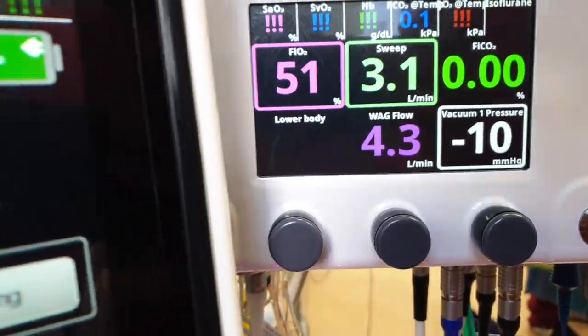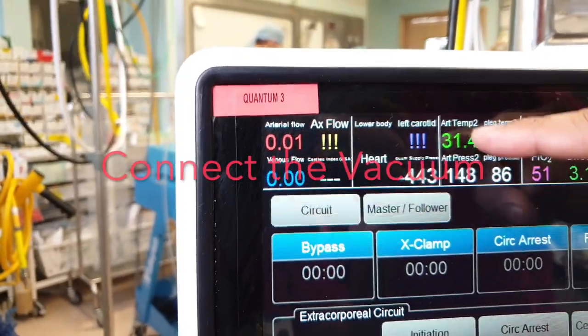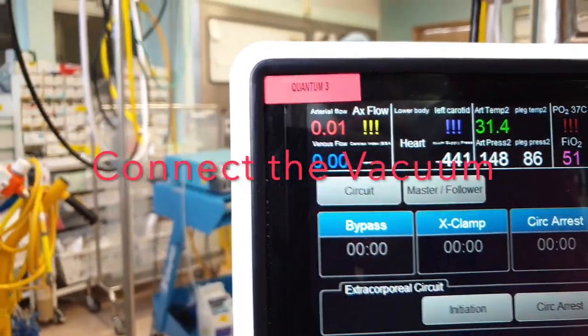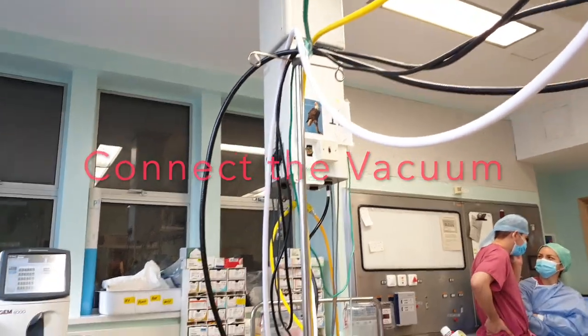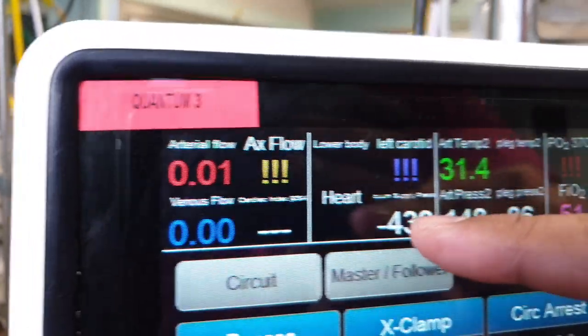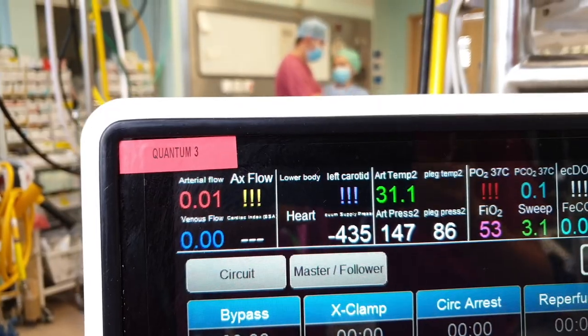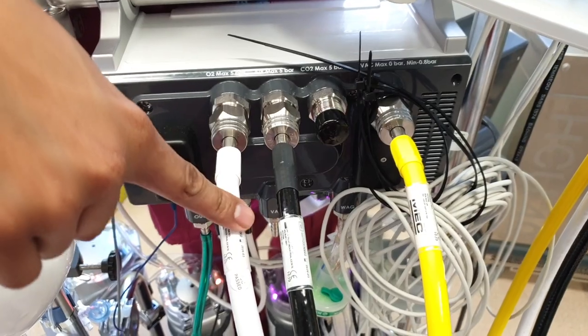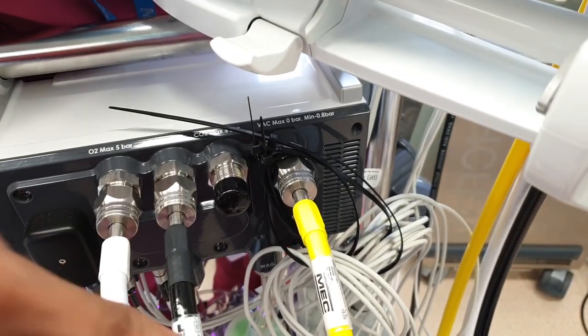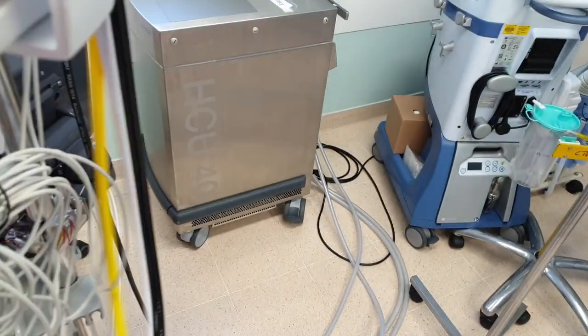I forgot to tell you, the first thing you have to check is this one. Make sure it's connected to the pendant. It's reading usually here -300 to -500. It's good. The gas is here, and this is your vacuum. Vacuum is always connected to the pendant.